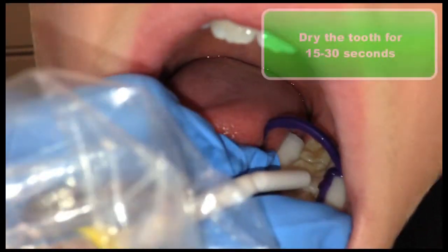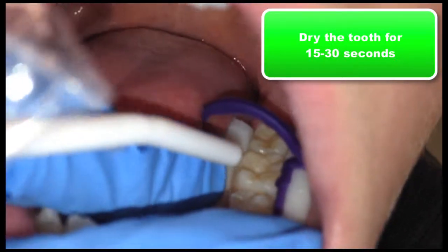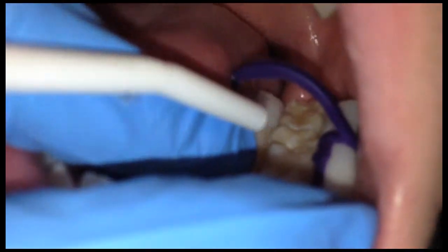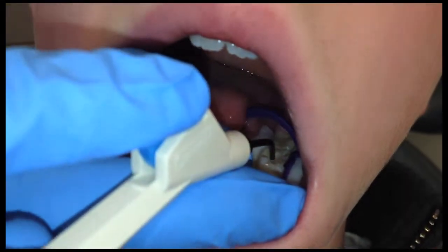Dry the tooth for 15 to 30 seconds. Make sure the tooth is thoroughly dry. The tooth should appear white and chalky. Now you can apply your sealant material.